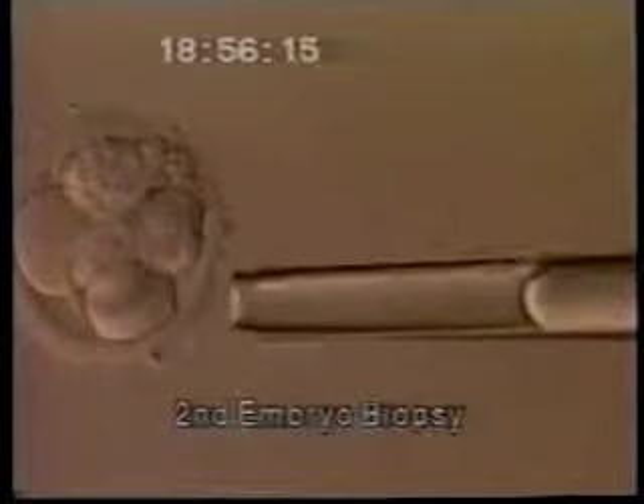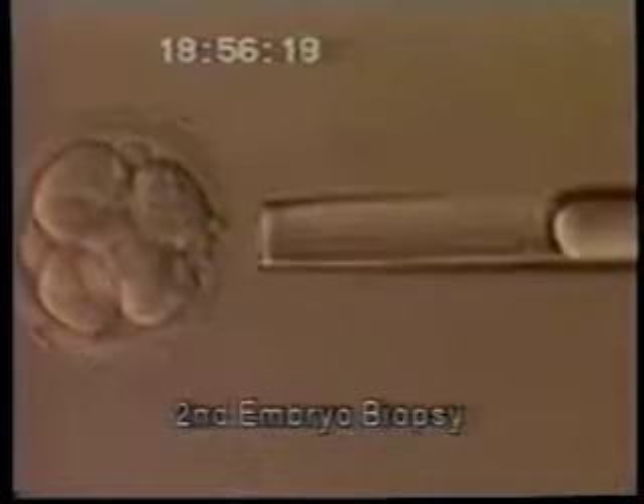More importantly, we can remove two out of eight cells so that we can test whether or not this embryo can genetically result in a viable baby without severe lethal disease. Now we're putting a much larger pipette through the hole created by the smaller drilling pipette, and we're going to decide which blastomere can most likely be gently teased out without damaging the rest of the cells. We're in the process of gently pulling this cell out through some of the fragmented areas and through the hole in the zona pellucida without damaging either this cell or any of its surrounding cells. That biopsy looked relatively easy because the cell was not very tightly attached to its other components in the embryo.